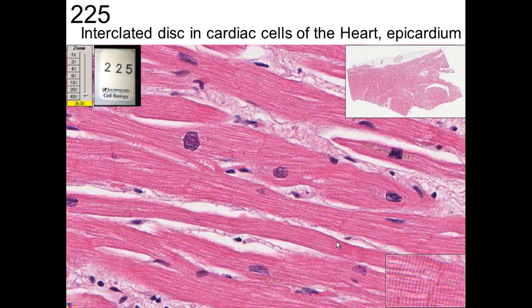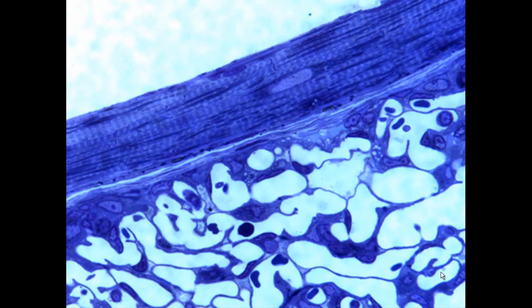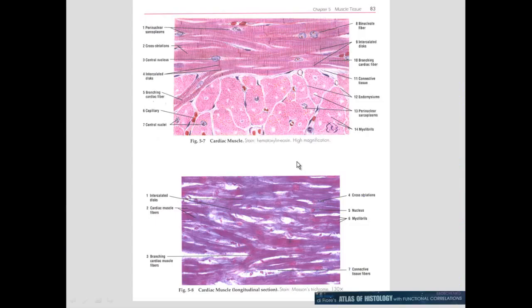So in the cardiac muscle we see some lipofuscin, we see the nucleus in the center. It's not a multinucleated cell. It may have two nuclei, but that's pretty much it, and it has the intercalated disc, which is where the cells are attached to one another. Again, we can see cardiac cells, the A and I band, and these long things here are mitochondria located in there, and this is in the lungs itself.